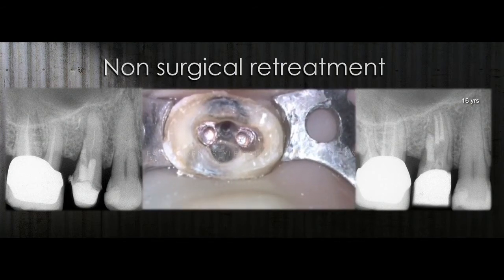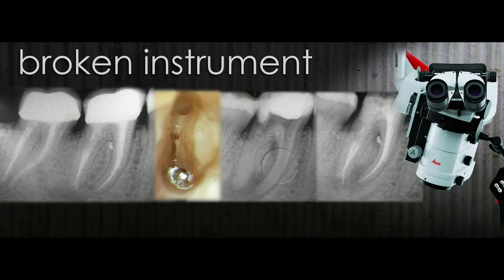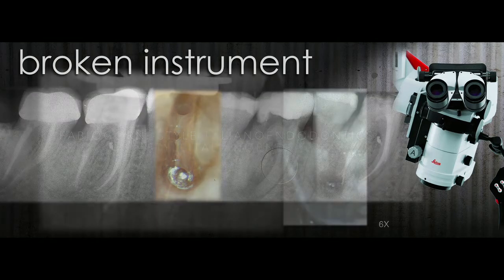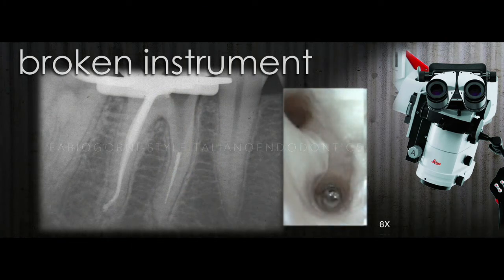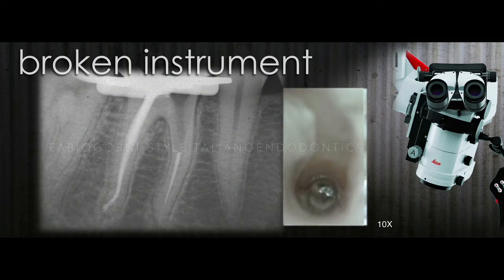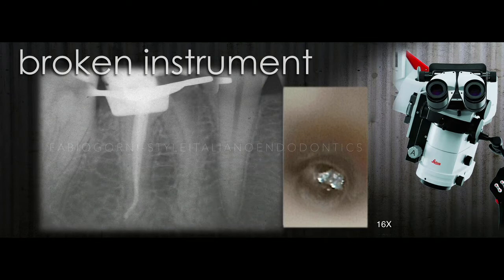So one of the problems that we have to face every day, especially today, where nickel titanium is one of the most used instruments in our work, is the retrieval of broken instruments. And we know that to resolve this kind of problem, we need a microscope. And most of the time, when we try to remove instruments inside of the roots, we can make another big mistake, perforations. So be careful.